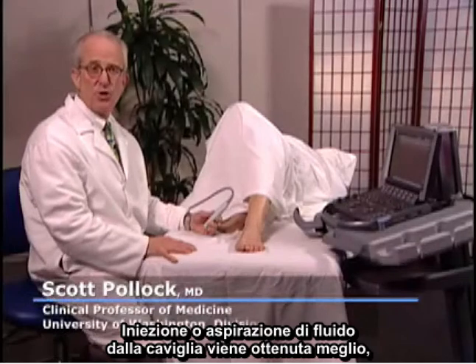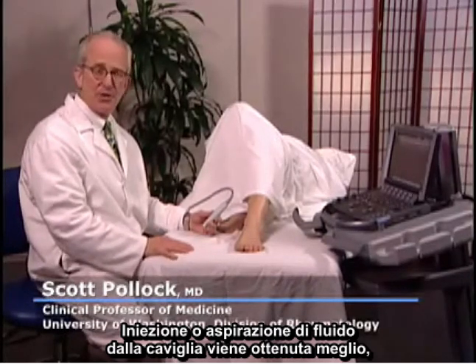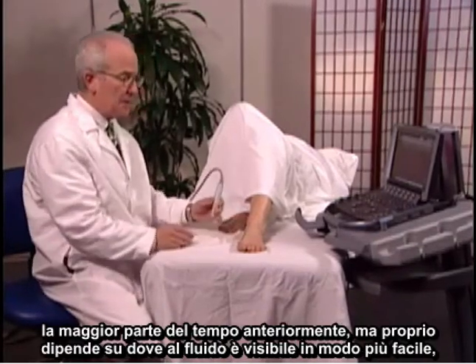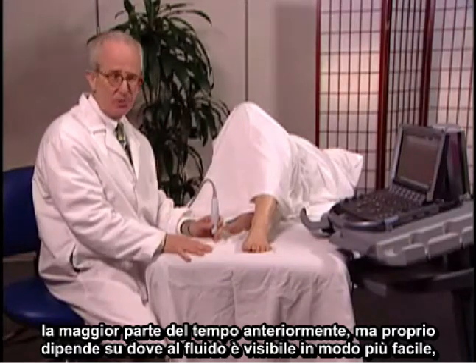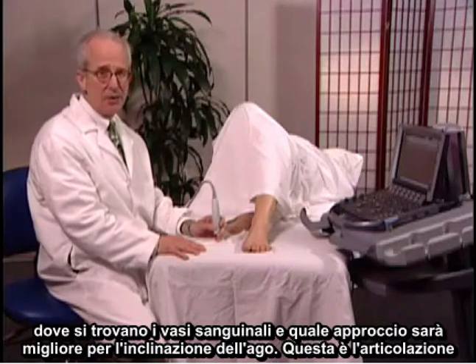Injection or aspiration of fluid from the ankle is best obtained most of the time anteriorly, but it really depends on where the fluid is most easily visible, where the blood vessels are, and what the best approach is for the angle of the needle.